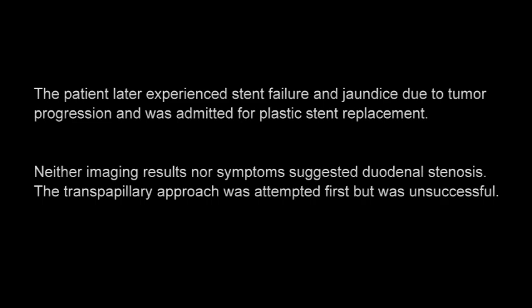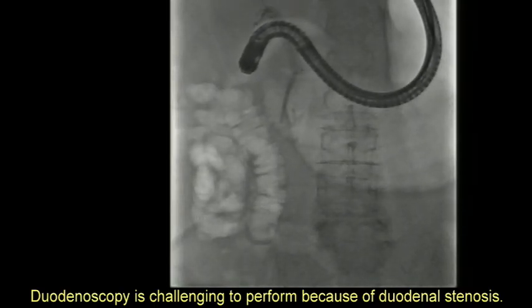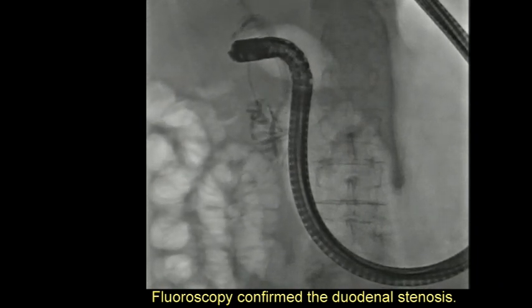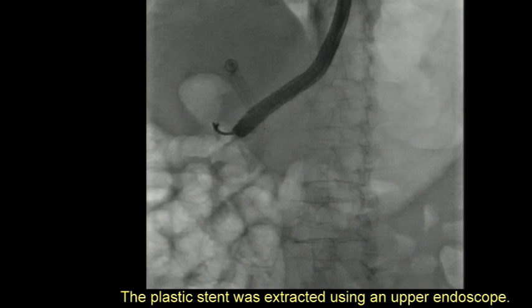Neither imaging results nor symptoms had suggested duodenal stenosis. The transpapillary approach was attempted first but was unsuccessful. Duodenoscopy was challenging to perform because of duodenal stenosis, which was confirmed on fluoroscopy. The plastic stent was then extracted using an upper endoscope.